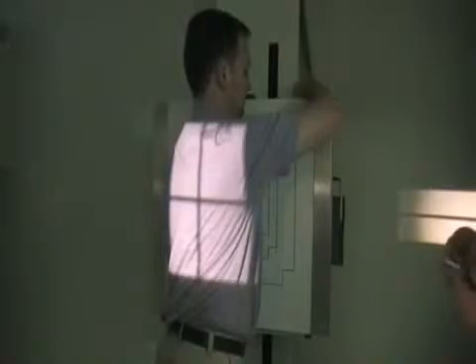Next, if we were doing the obliques of the ribs, what we have to keep in mind here regarding the PA obliques is the side that you are going for is going to be the side that is up or farther from the image receptor. So if I am going for the right ribs and I'm doing a PA oblique, we're going to have the patient turn 45 degrees and they're actually in an LAO. The right side is farther from the image receptor, but in essence, it's giving you the same projection as if you're doing an RPO. But always remember, PA obliques, the ribs are going to be farther away from the IR.